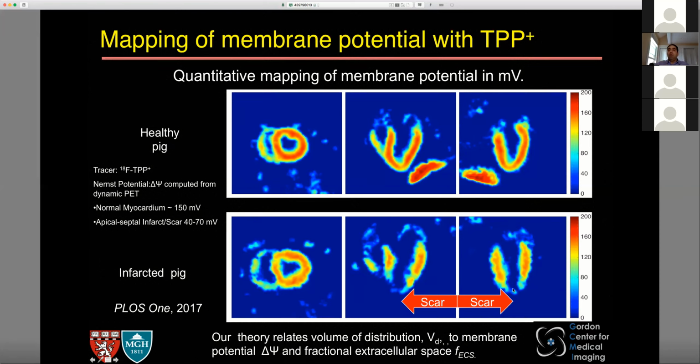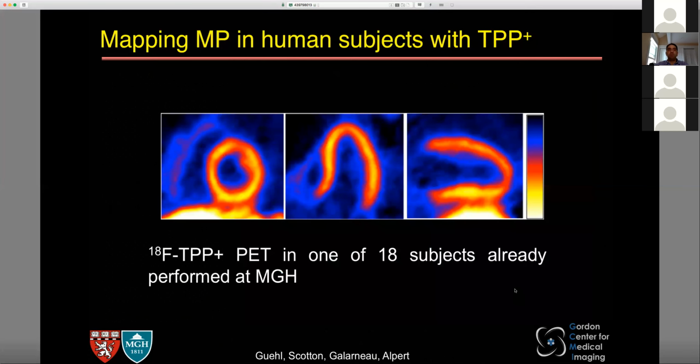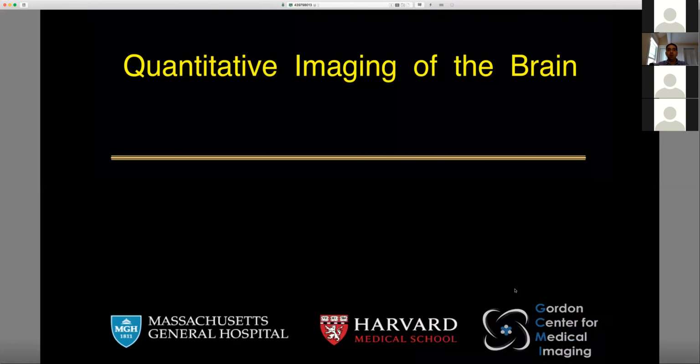That's a very good model of conductance that causes arrhythmias. And with PET, we can detect that and know which areas to treat. So that's very valuable when you're going to be mapping the condition of a patient, and you can measure it only with PET-MR. All right, and here's an example of a patient study of the heart with PET-MR.